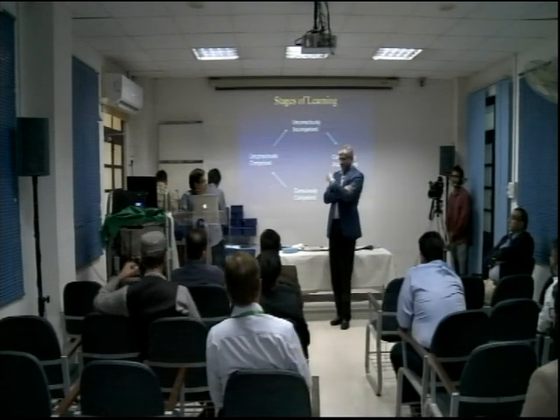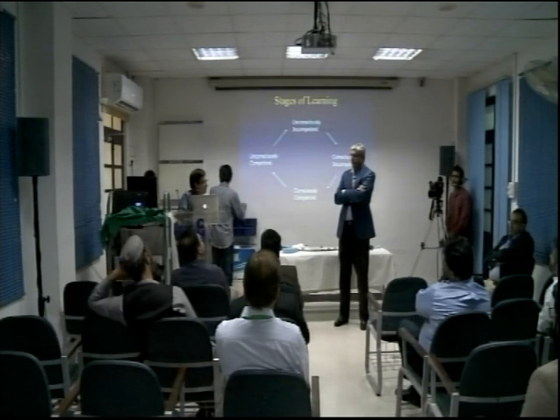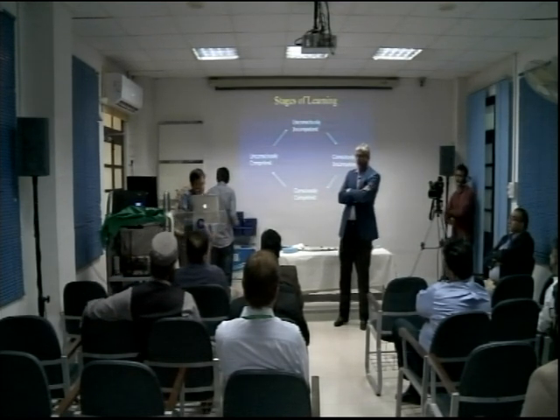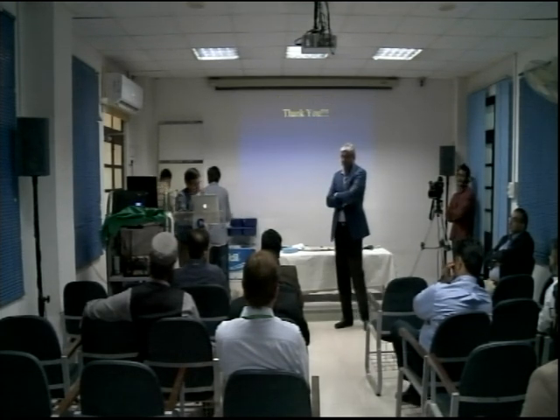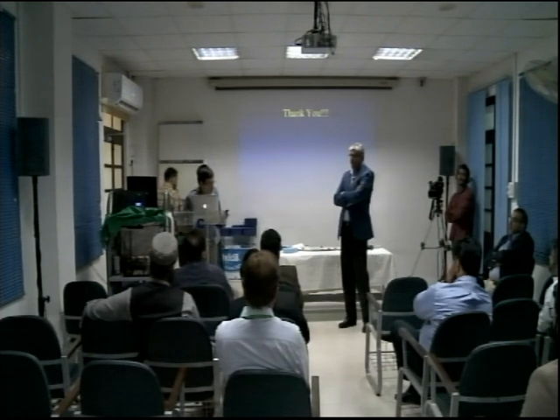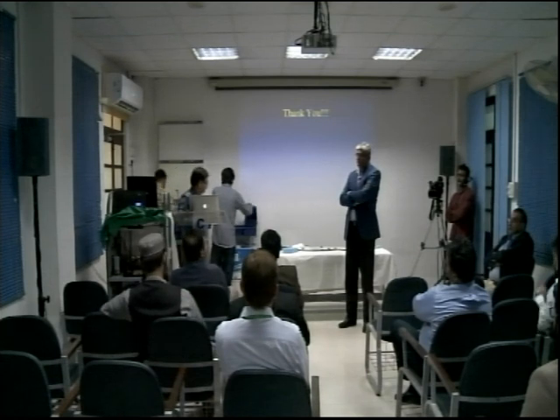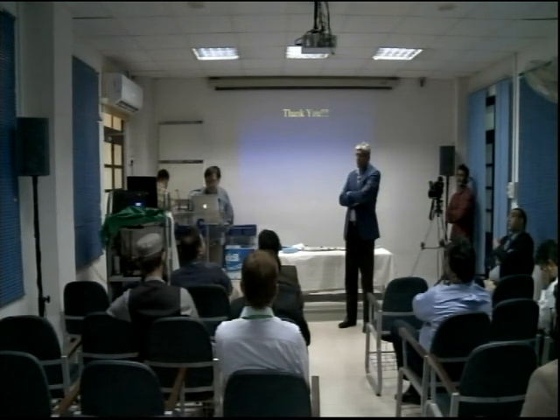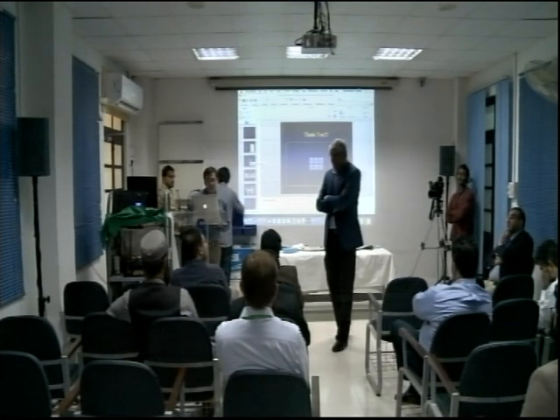The reason I mention this anecdote is that we all have our own preferences, but I think all techniques work in good hands. One thing might not work for you, but it might work for Khalid very well, and what Khalid might be doing, I might not be doing. This debate happened at the last PSSLD meeting. Half of the operators were advocating below up, and half up-down. What I would like to know is how many of them were actually doing that regularly.